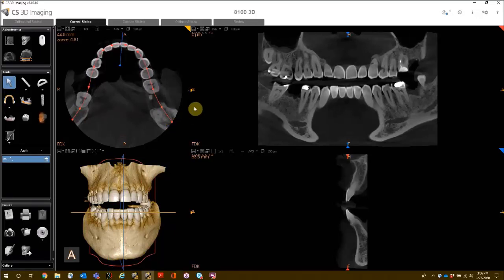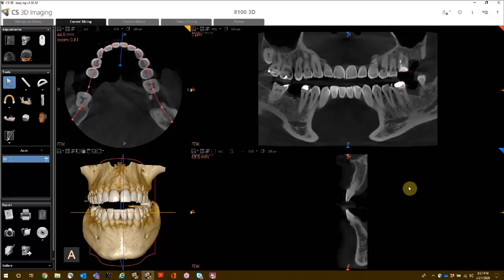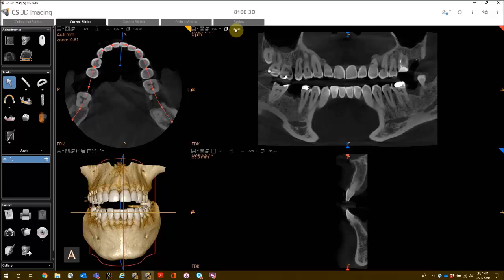On the right side of your screen, you will see your reconstructed panoramic image in the upper right, and in the lower right you will see the oblique coronal view screen — you may also have heard this called the transaxial view. If your panoramic image doesn't look quite clear, it is set in the native resolution the image was taken in — in this case, 150 micrometers.